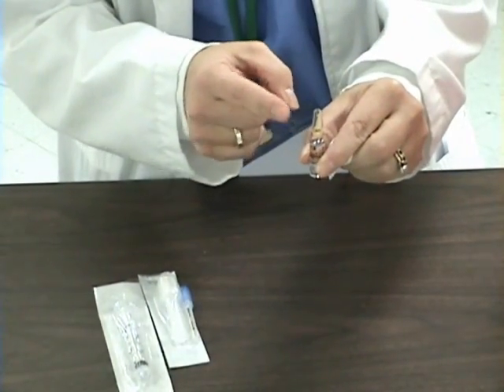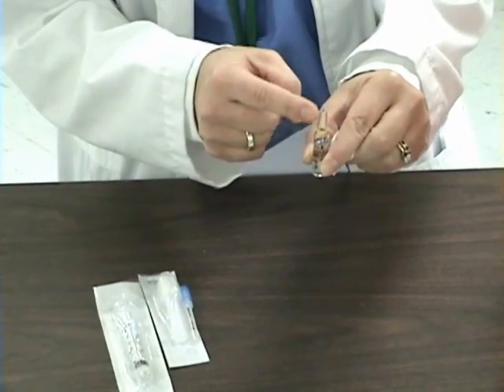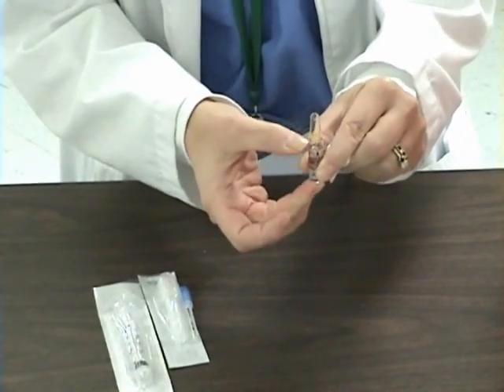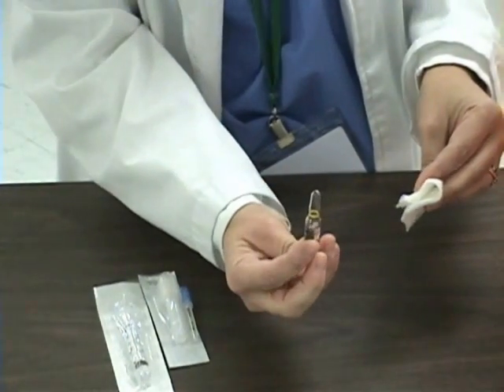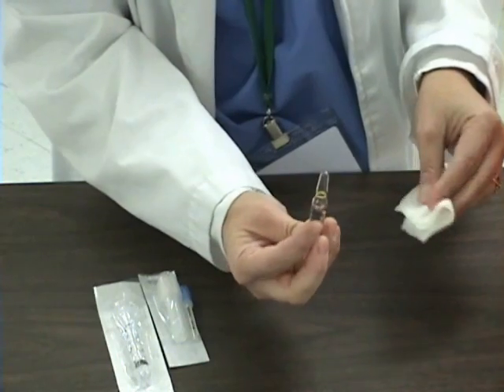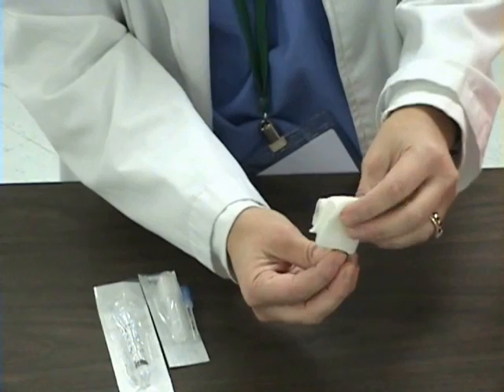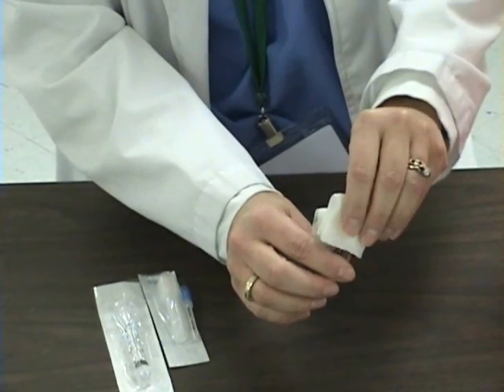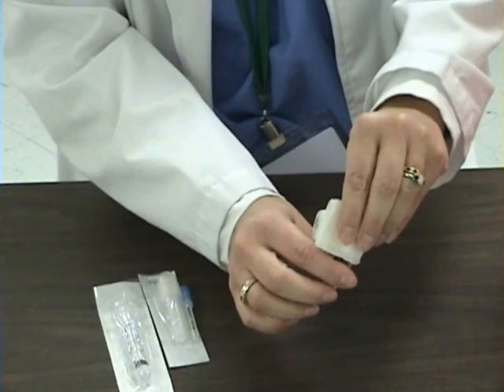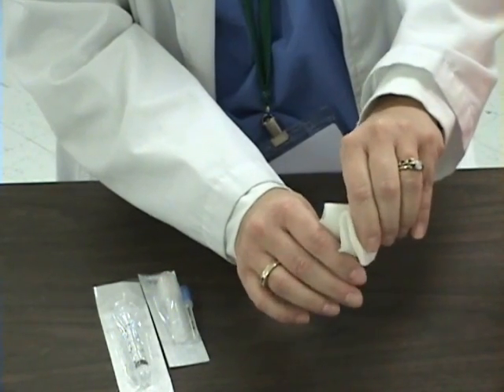Another thing I want to do before I open this is gently tamp my ampoule, if there is liquid or medication in it, so that the medication goes to the main part of the ampoule. I will wrap the gauze around the neck of it, then go ahead and crack it open away from me, so that there are no splinters of glass going towards me.